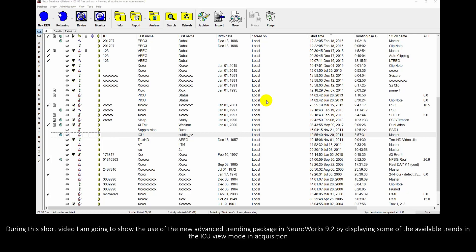During this short video, I'm going to show the use of the new Advanced Trending Package in Nearworks 9.2 by displaying some of the available trends in ICU View Mode in Acquisition.